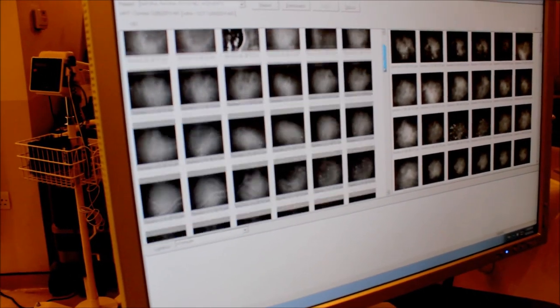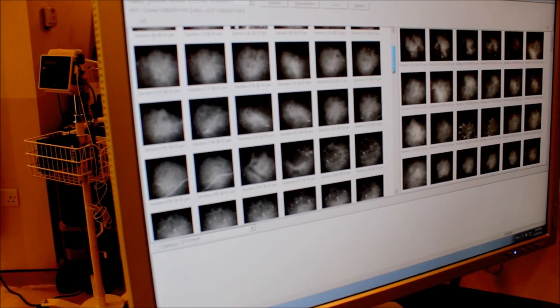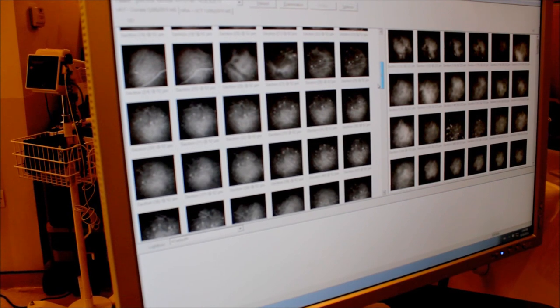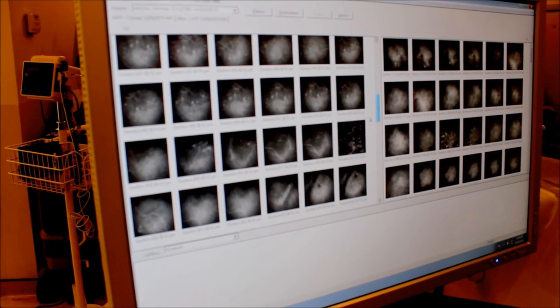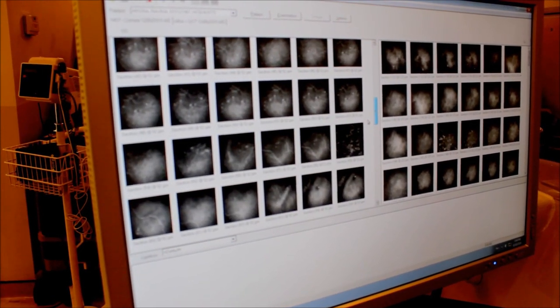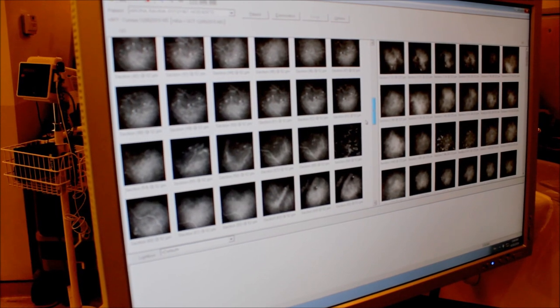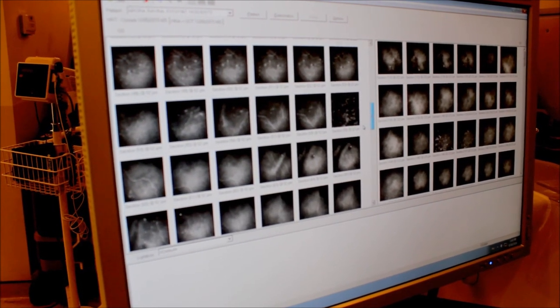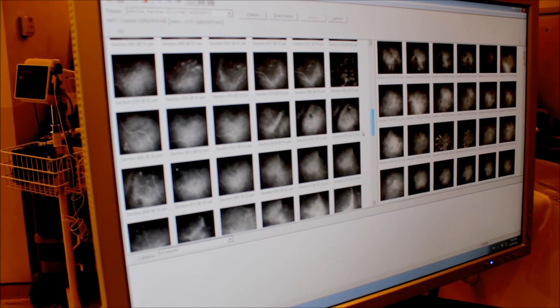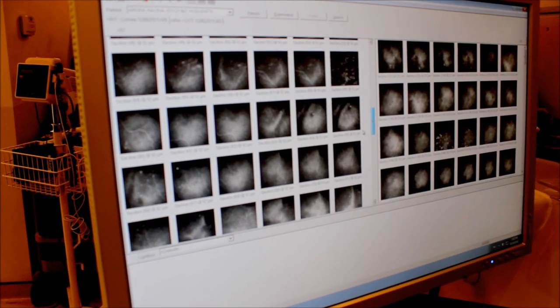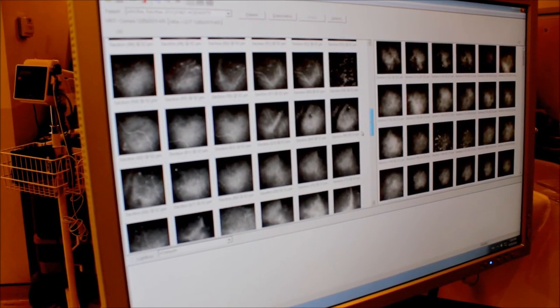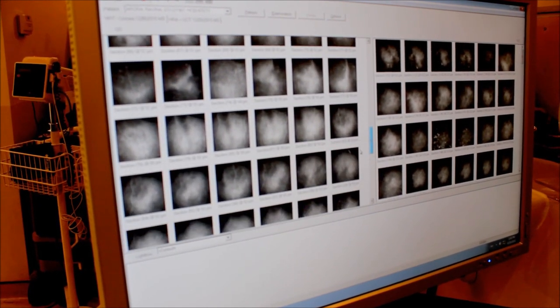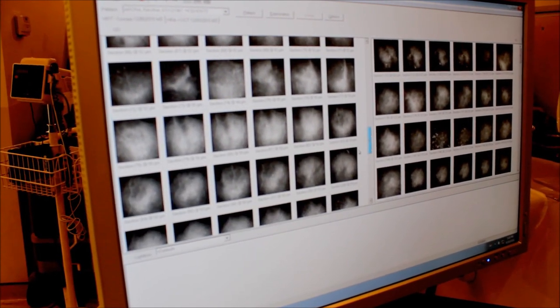So we create a range of these images. We have a quick browse through the images just to get a feel of what's the density for the patient. The nerve density across images should not be variable for anybody who hasn't got a reason for neuropathy, but will be variable for anyone who has neuropathy.